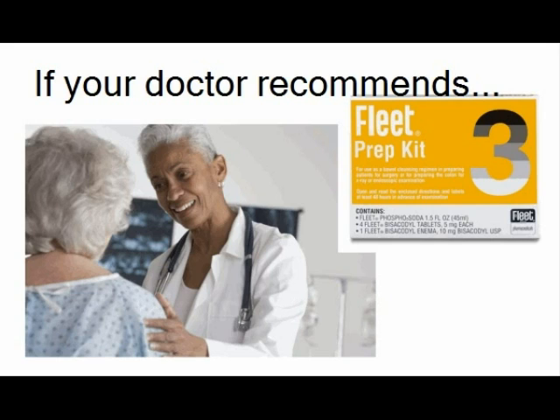With this order, the doctor will also prescribe what's called a prep kit. This prep kit will attempt to flush the patient's system prior to the exam to allow for an unobstructed view of the patient's bowels. The patient will also be asked to be NPO after midnight prior to the exam. NPO stands for nil per os, which is Latin for nothing by mouth. Again, we don't want anything obstructing the radiologist's view of the anatomy.